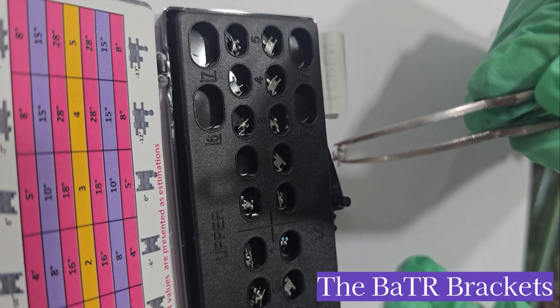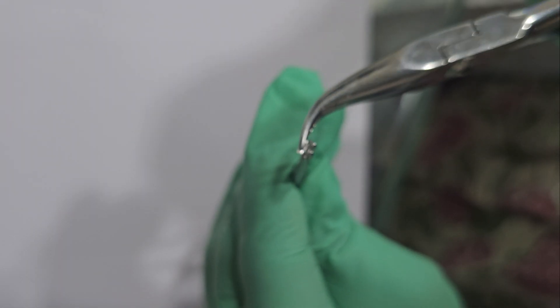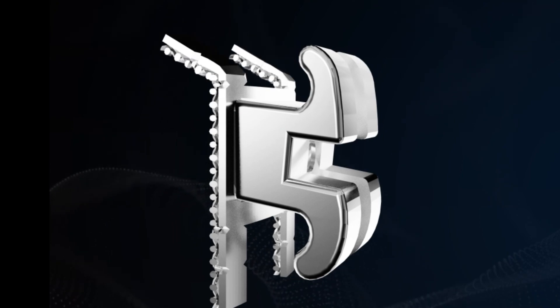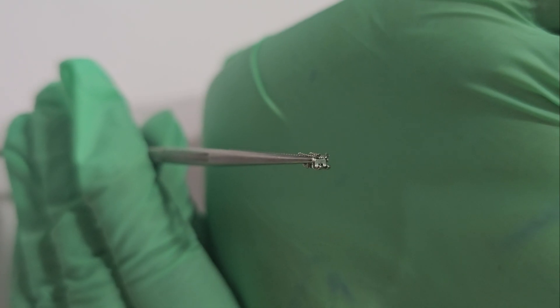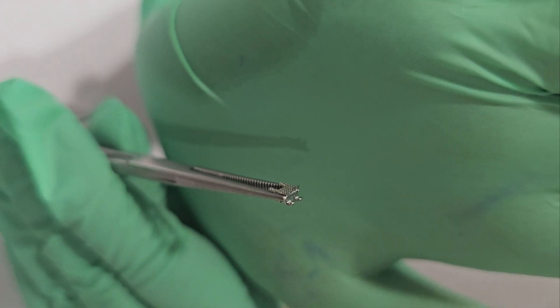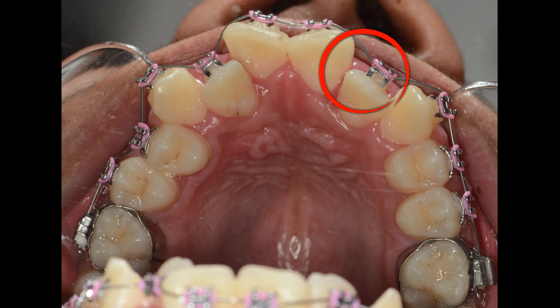The bracket system we used was the BATR bracket system. We turned the legs of the bracket by 90 degrees. The gingival legs of the canine brackets were bent, and the occlusal legs of the lateral incisor brackets were bent and then bonded to the teeth. On insertion of rectangular wires, we will get a palatal root torque in the canine and a labial root torque in the lateral incisor bracket.